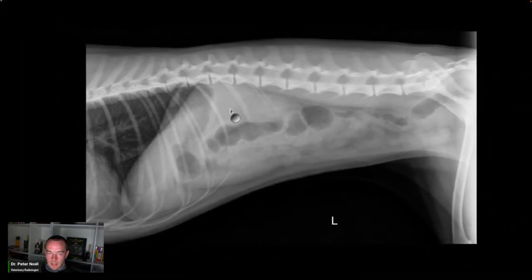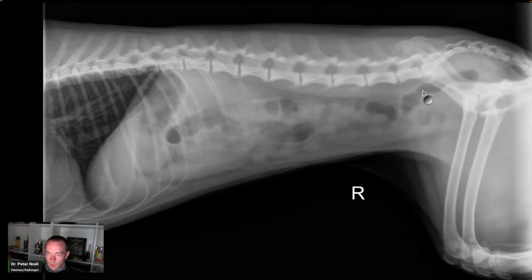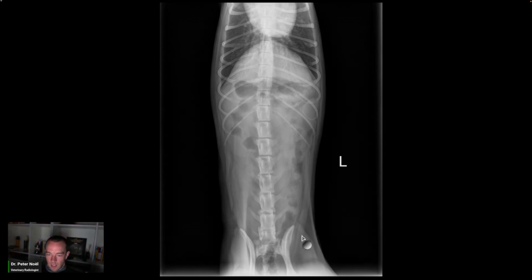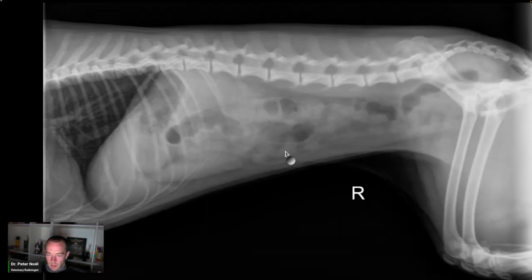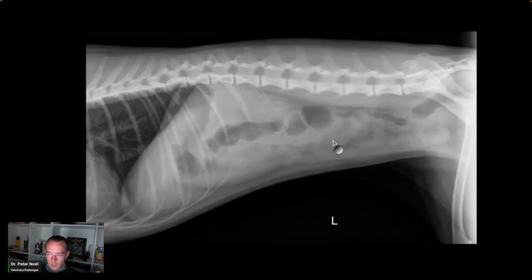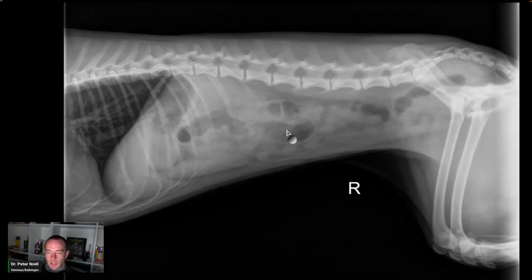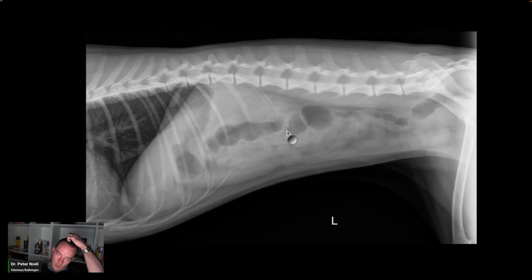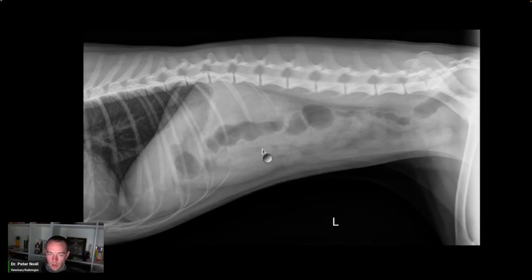Anything in here is fair game for colon — gas-filled colon, fluid, this is probably the cecum. Everything is following the way it should be. This is a dog with gastroenterocolitis and no obstruction. I'm very confident this dog is not obstructed, so I don't think you need to come back and reimage unless it hasn't responded well to supportive care within 24 hours.